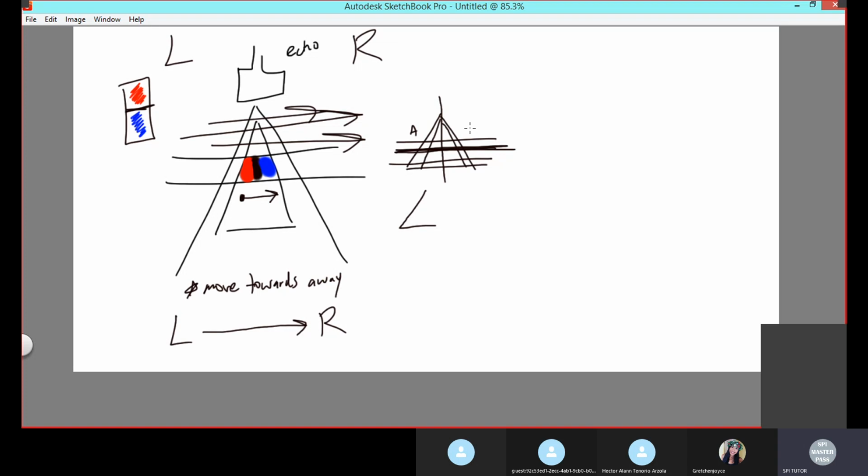That's what I would think. And I think in the book, the indicator is on the left side. So that's why it's marking left. Because normally the indicator is actually on the other side. So wherever your indicator is, that should be where left is for the sector. I wouldn't get too confused about the sector. I would focus more on the linear sequential, the linear, which is the one I'll do next. Because if you ask questions, it might be more about that than this image.